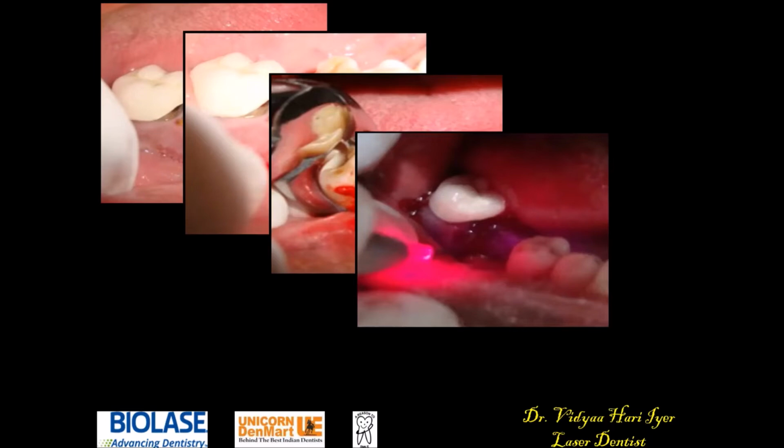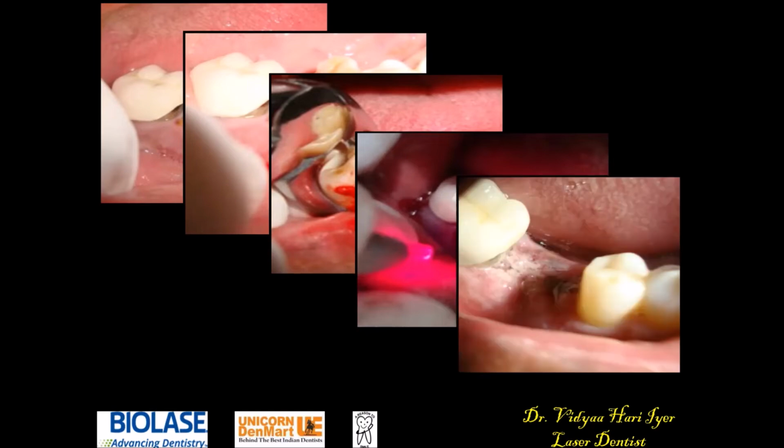Now, this is very important, especially in today's times, where you don't want any secondary infection. You want to get a tooth removed, and you don't want an infection or a pain or a swelling, or even at times a second visit to your dentist, right? So this helps you have single sitting procedures, and also reduces the amount of medication, especially during the pandemic. And now you can see the healed area, and this is a 24-hour healing mechanism. Next, I'm going to show a case of crown lengthening.